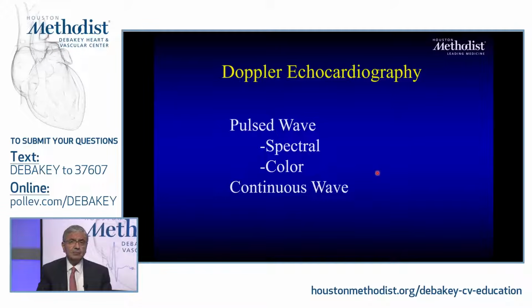And the question that we're answering when you send the ultrasound beams, these packets of ultrasound, is how deep is it? Meaning how long did it take for the ultrasound to come back? And how bright is it? Differentiating different structures. So that's as simple as that from an imaging point of view.